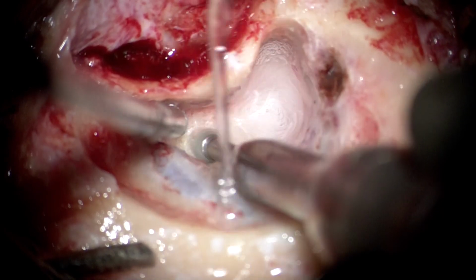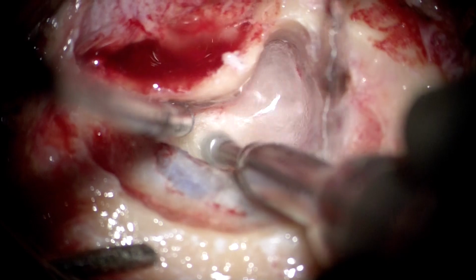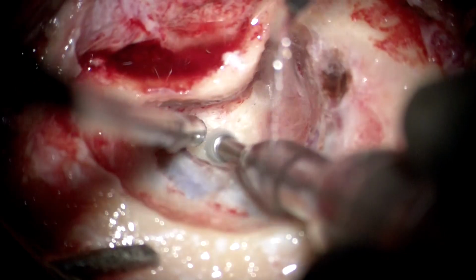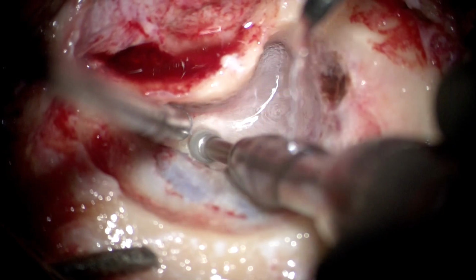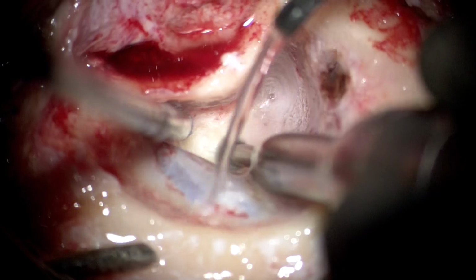And these are again, one going through the labyrinth. One has to understand this is the hardest bone in the body, and gentle strokes, even with a sharp cutting burr, are often not enough. There has to be a requirement of a slight pressure exertion, which could be learned in the temporal bone exercises, to be able to drill the labyrinthectomy.